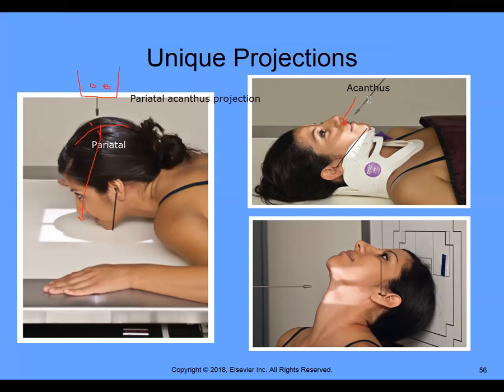On this picture where you see the acanthion, the acanthion is not an anatomical part. That is just a landmark that we use. We're going to be learning about different landmarks when you get into the skull. So the acanthion is between the nose and the lips. And in this X-ray, I don't know if you can see it, but you can see the shadow of it.